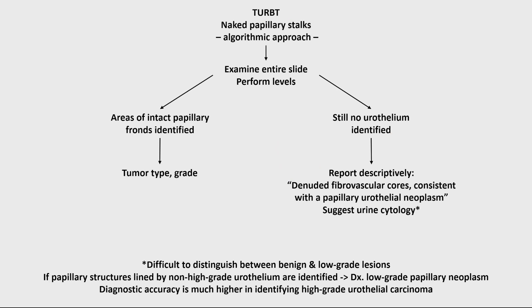What can you do once you've established you have naked papillary stalks? First, you have to examine the entire slide and all slides from the same patient. You could perform levels if you have sufficient material — all in an effort to identify areas of intact papillary fronts where, if present, you can establish tumor type, grade, and everything. But if even after performing levels and examining all the slides you still don't have any intact urothelium, you may want to report this descriptively. For example: denuded fibrovascular cores consistent with, or highly suspicious of, a papillary urothelial neoplasm.